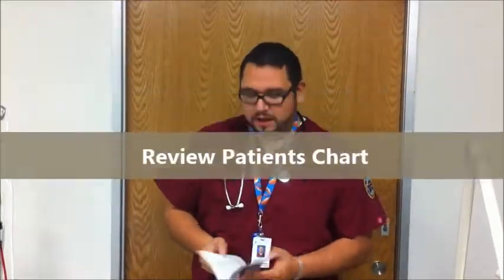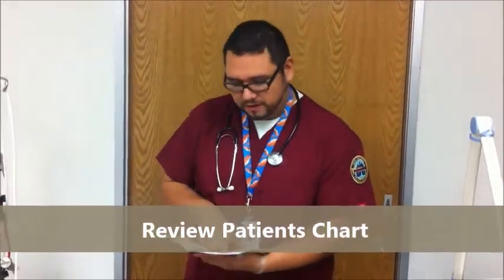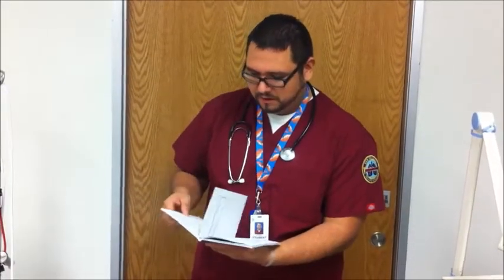First, what we're going to do is check the chart, verify the patient's information, and check the orders that the doctor has given for the patient. Okay, everything's all in order. Next, we're going to go wash our hands.